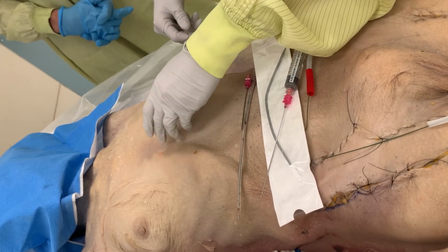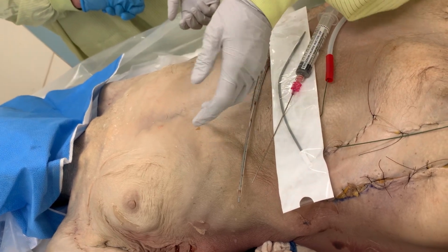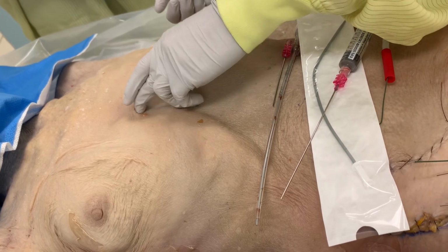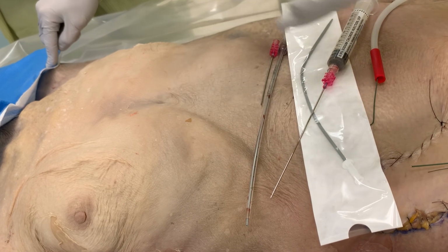To begin, collect the supplies and position the patient supine, with the head of the bed raised 30 to 45 degrees. Palpate the xiphoid process medially and the last thoracic ribs laterally, which form a triangular space. Sterilize the skin and create a sterile environment.